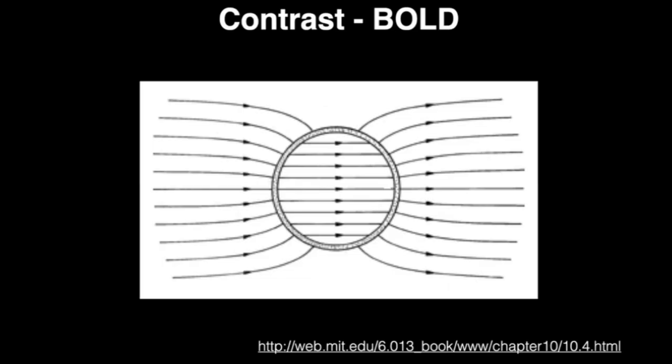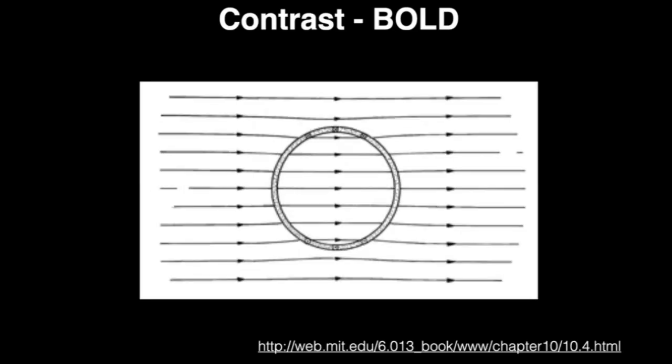That means the magnetic field is stronger inside the blood vessel. Outside the blood vessel is tissue, and there it's more pure water cells, and that's more diamagnetic. Field is weaker there, field lines are further apart. So there is this field gradient between intravascular and extravascular. And this will cause the MR signal you try to detect in here to decay away much more quickly than what happens in this case.